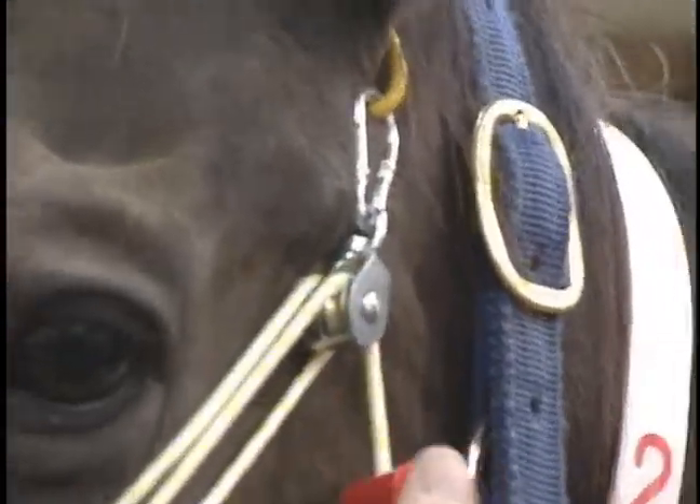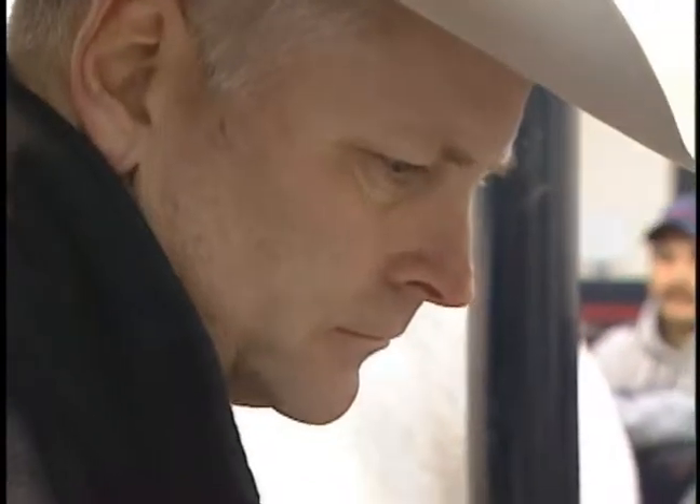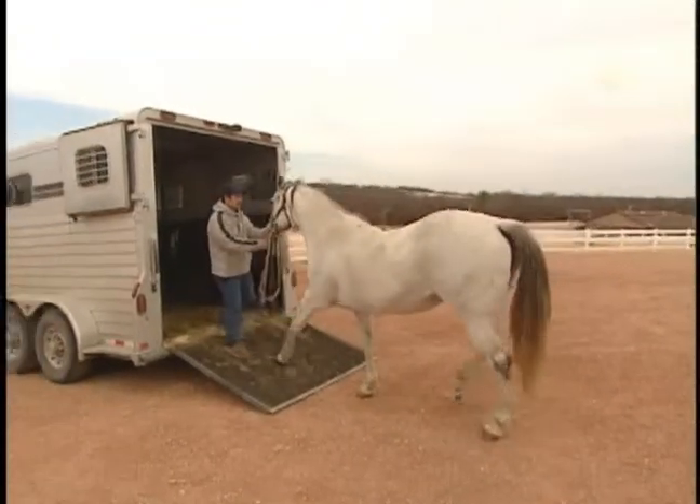We use the Stabilizer on certain procedures here at the ranch and find that horses in general tolerate it very well. When you use it in the proper form and the proper way, it's a very humane method to calm horses and allow us to do the procedures we need to do. Any time you have a horse that's more calm during loading in a trailer or moving to a new area, the safety with the handler is better. It all comes down to taking care of the people handling the horse first, so they can take care of the horse second.